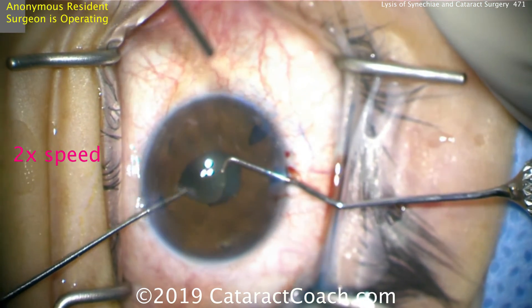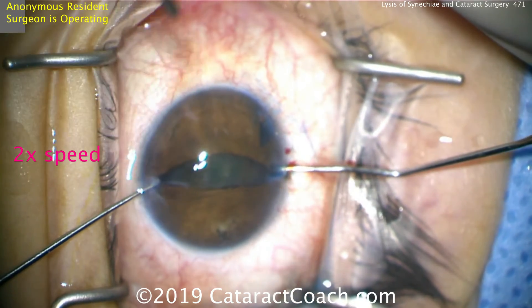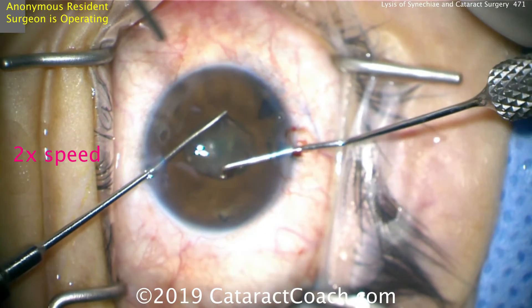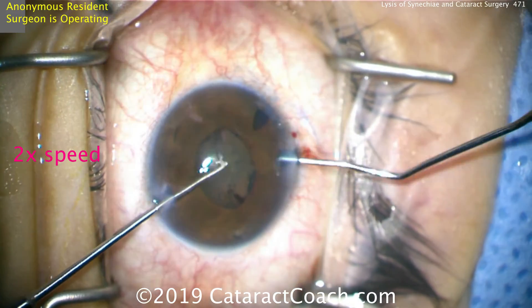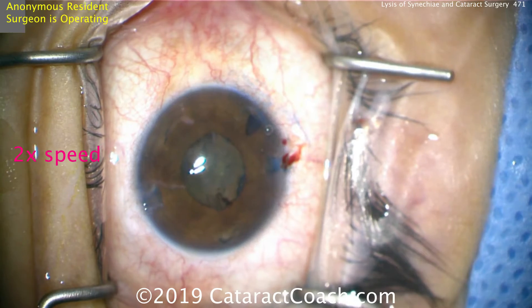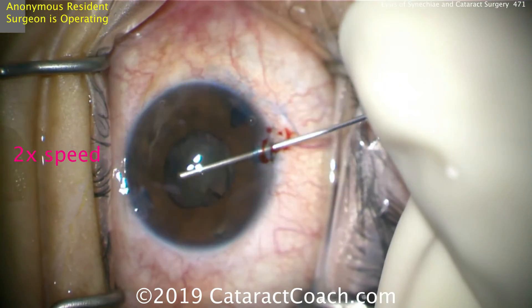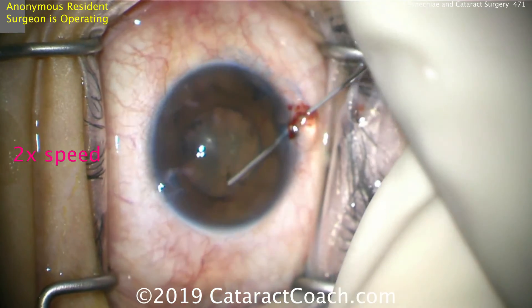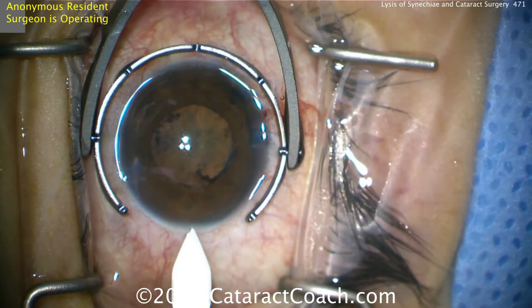We do a pupil stretch — nice good stretch — and go in opposite directions as well to get this pupil stretched out. Now there is a pupillary membrane: a little bit of that fibrotic membrane on the pupil margin. So let's first put in more viscoelastic to get some viscomydriasis, get the IOP up, and then make the main incision. All of that was done with just two paracenteses.